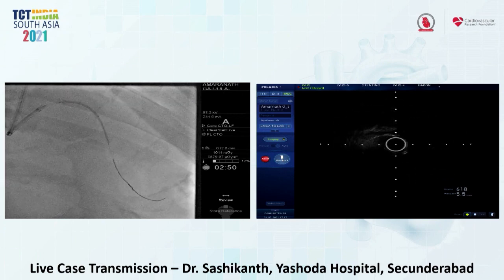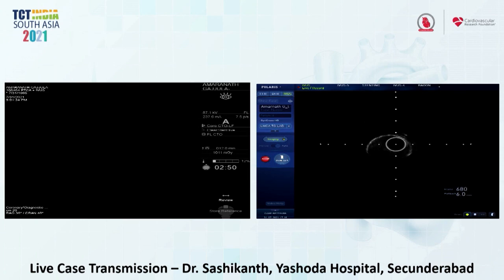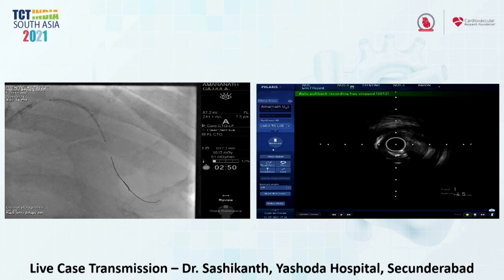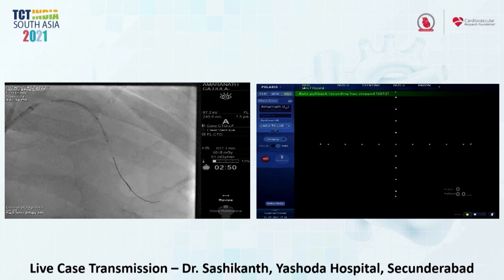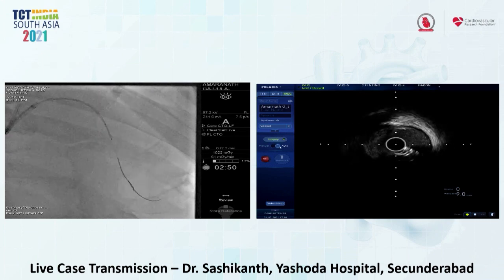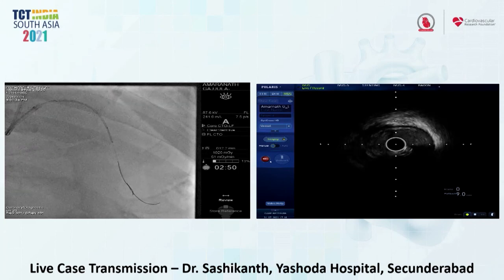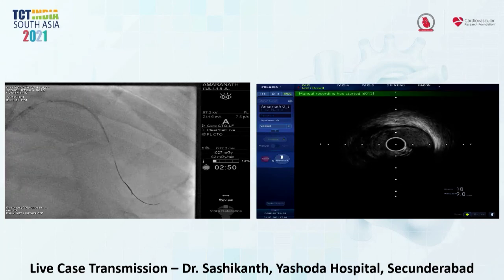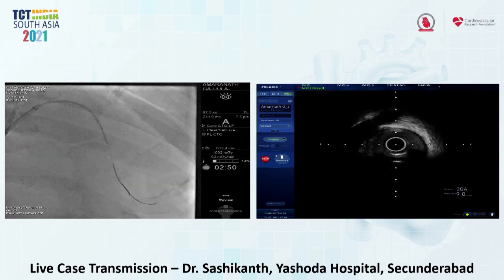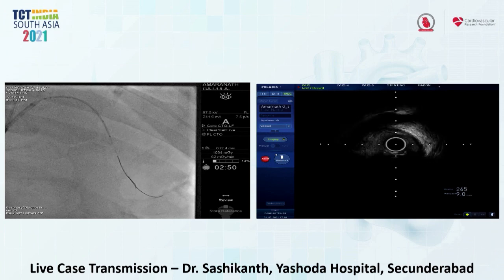You should know this. We can jail the IVUS catheter. The camera, the most part of the IVUS catheter is out actually. Can we push the IVUS catheter a little more in? Yes. Stop there. Live image, please, of the IVUS. Okay, that's good position. We have a mild plaque in the proximal LAD. Pull back a little bit with the IVUS catheter. See the ostium of the circumflex. Okay, I think that's a good position there.